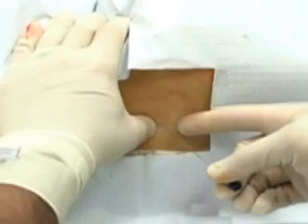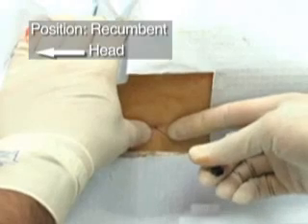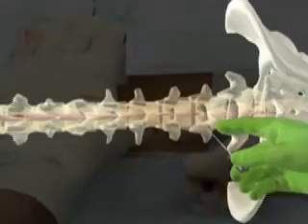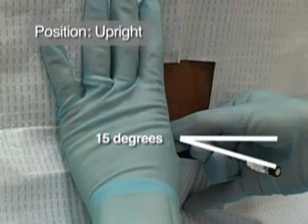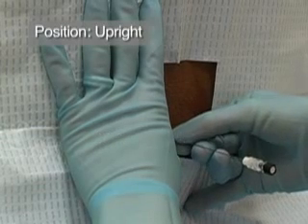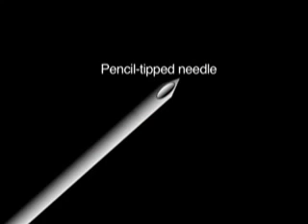Identify the anatomical landmarks once again and insert the needle with stylet firmly in place in the midline at the superior aspect of the inferior spinous process, directing it at an angle of approximately 15 degrees, as if aiming at the patient's umbilicus. Either use a pencil tip needle or ensure that the bevel of the needle is in the sagittal plane in order to spread rather than cut the fibers of the dural sac. These fibers run parallel to the spinal axis. The use of this needle position should theoretically decrease the leakage of cerebrospinal fluid.